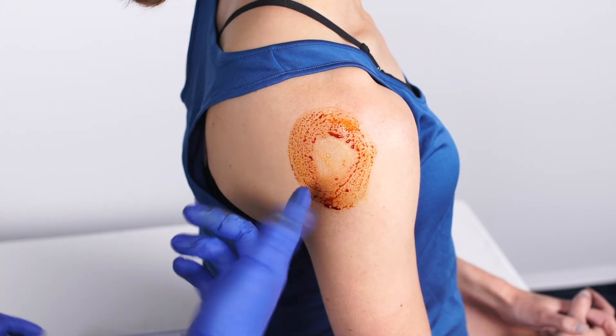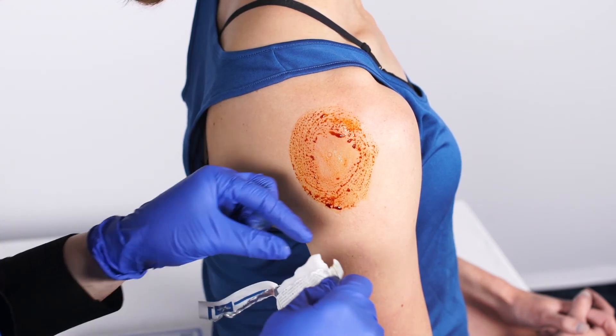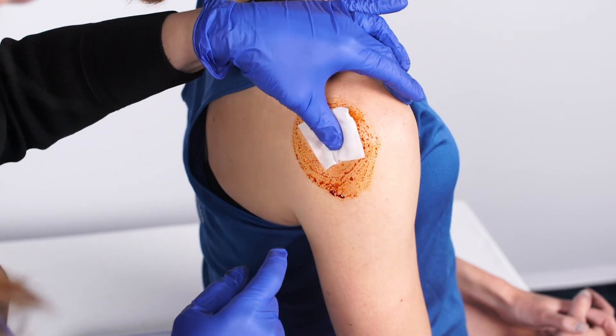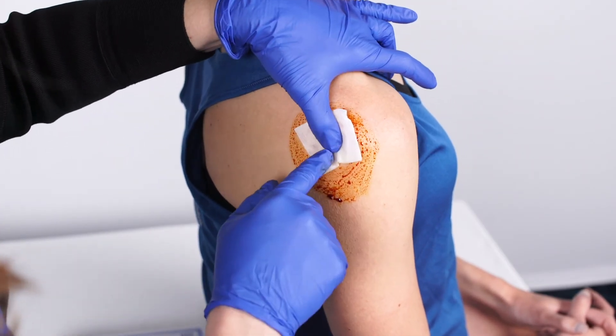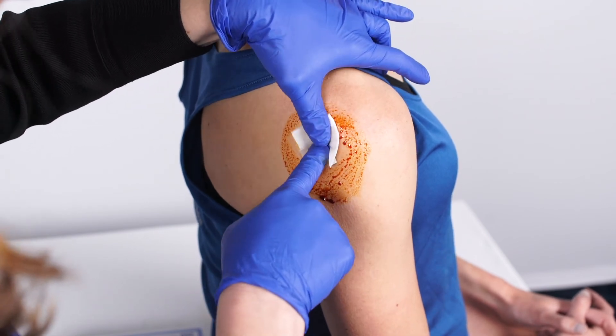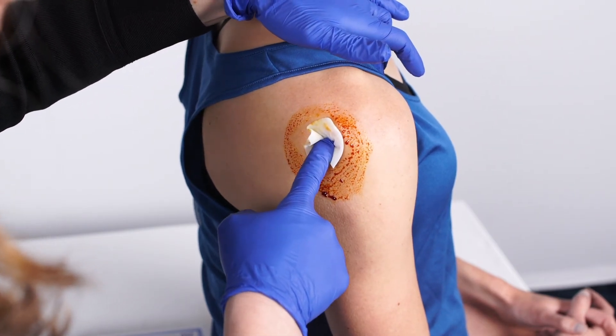You'll see the skin turn white — that's just because it's very cold. Then the last step: I take another alcohol swab, holding it by the end to keep it sterile, and triple-check my spot, feeling the posterior lateral corner and using my index finger to feel exactly the approach I'm going to take, angling towards the coracoid anteriorly.